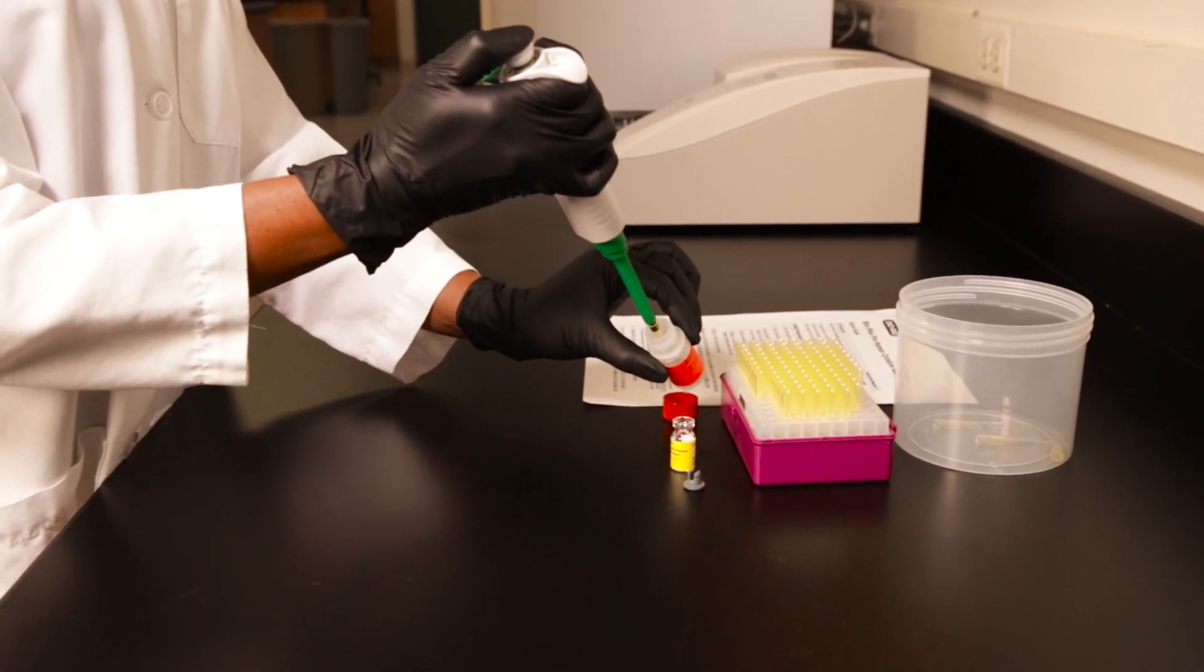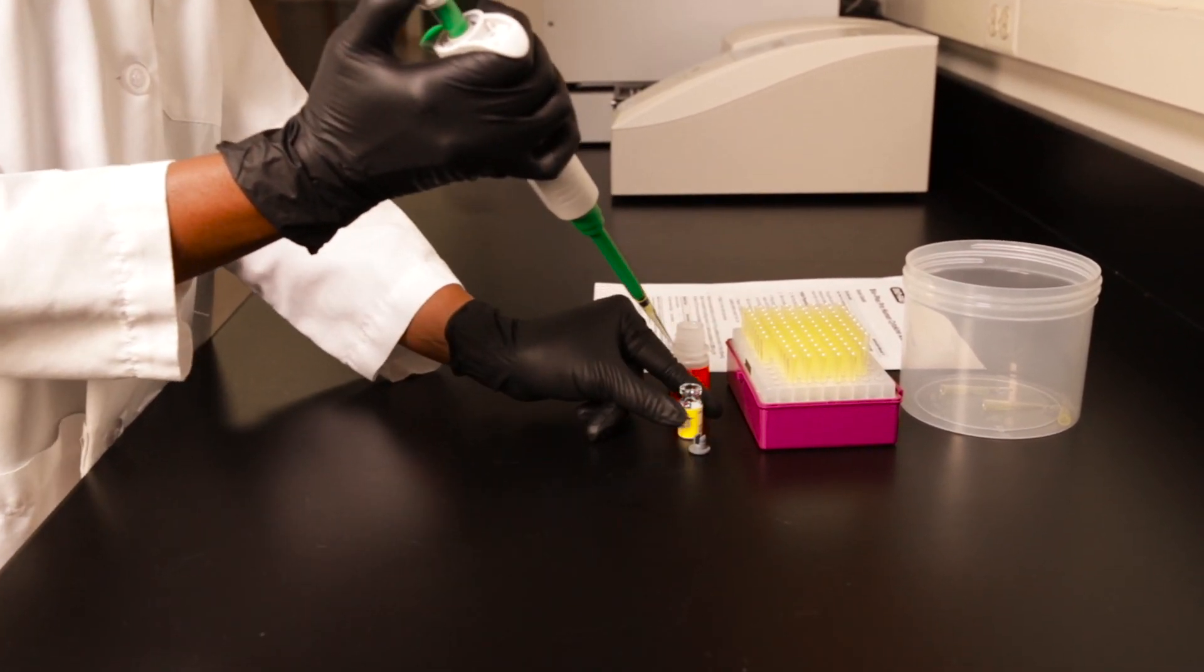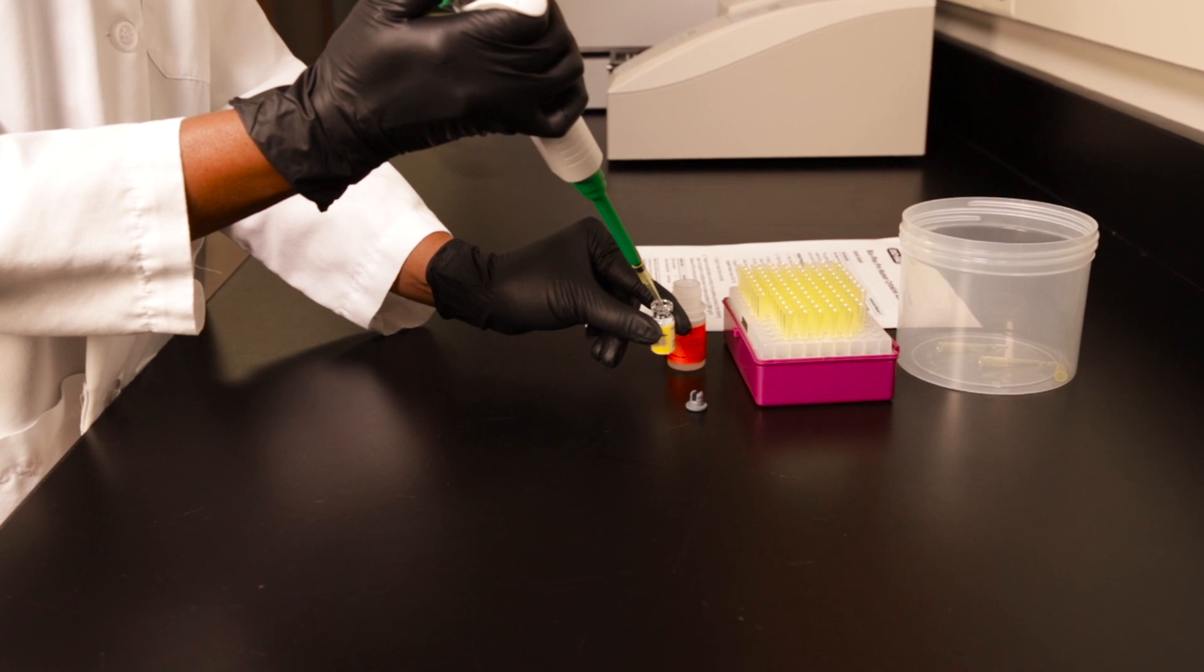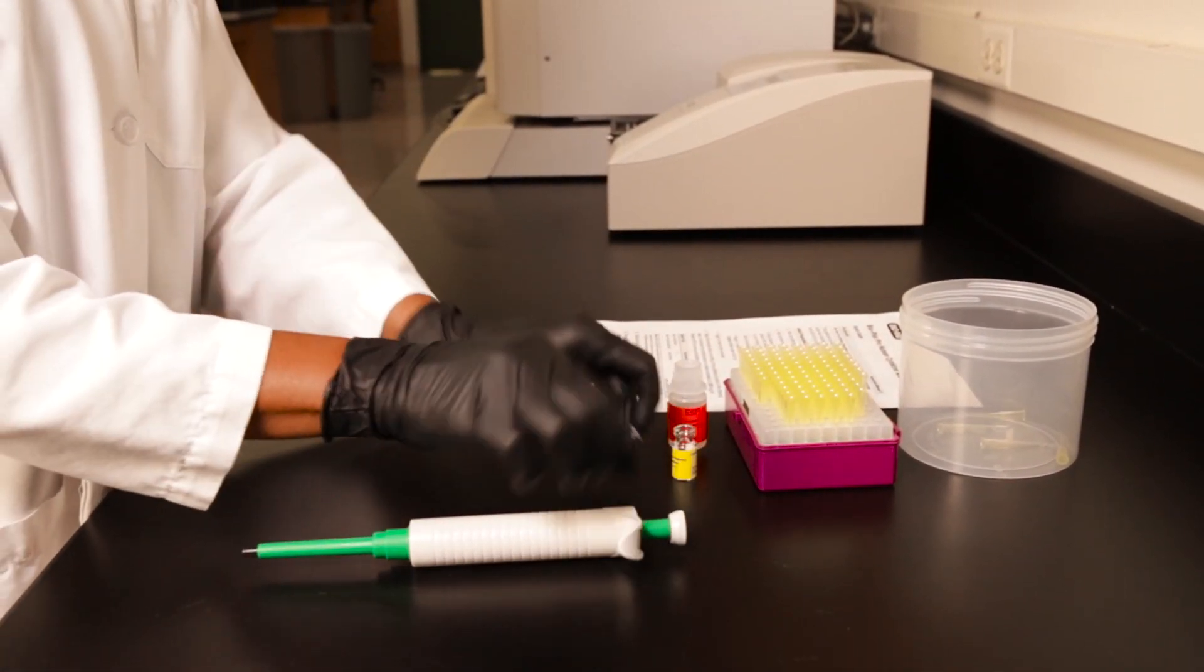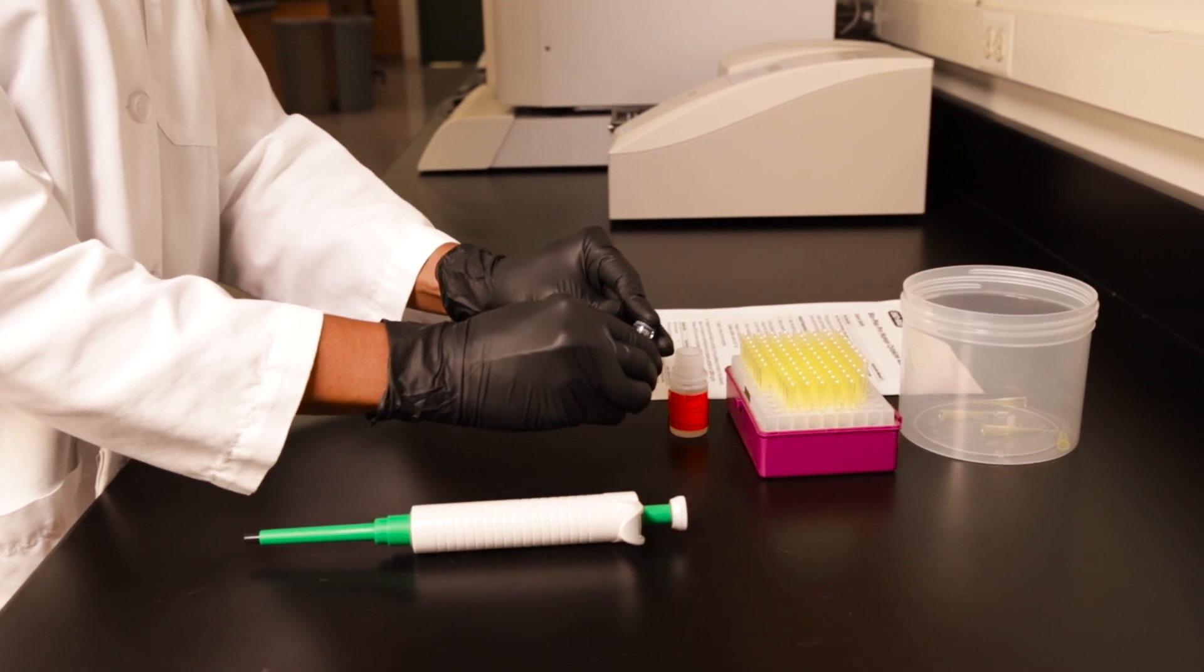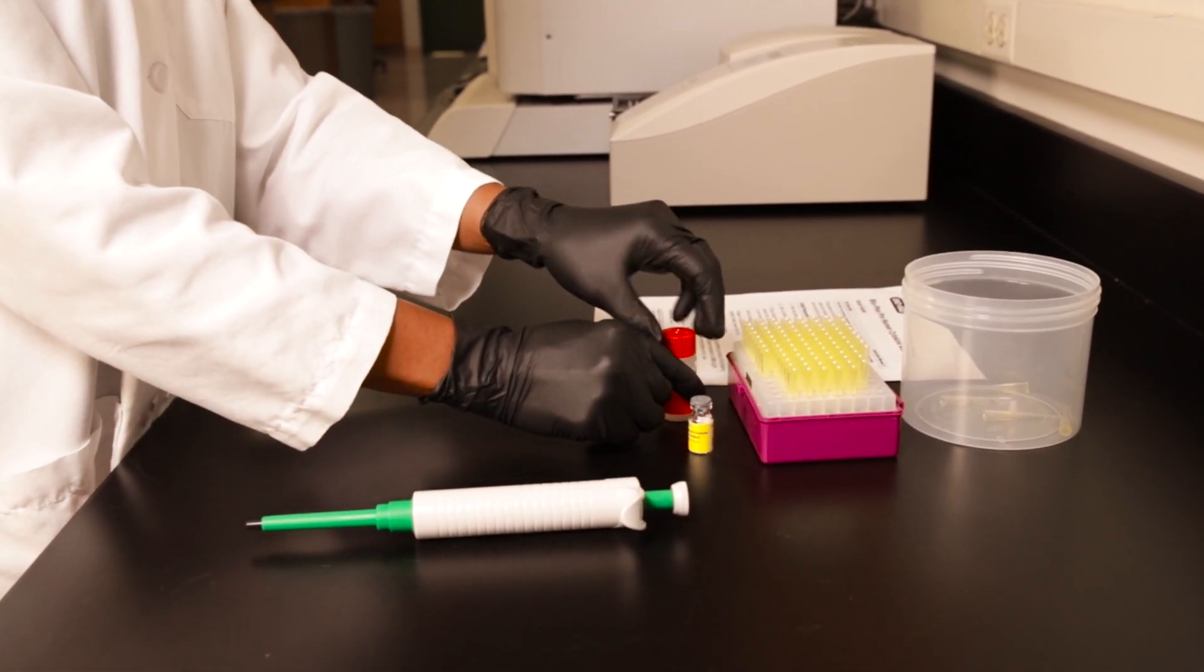The kit comes with standard diluent and sample diluent optimized for serum and plasma. For any other sample types, reconstitute the standard using a diluent similar to the sample. For example, when working with tissue culture supernatant samples, use the same cell culture media to reconstitute the standard.